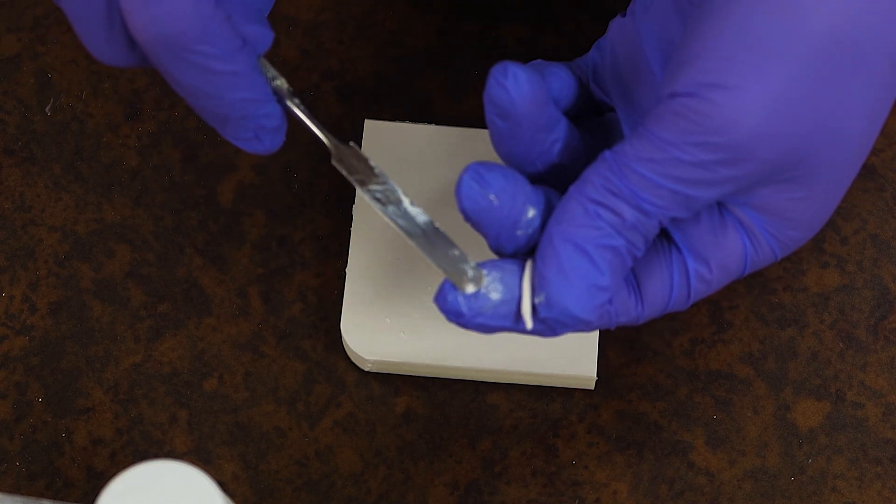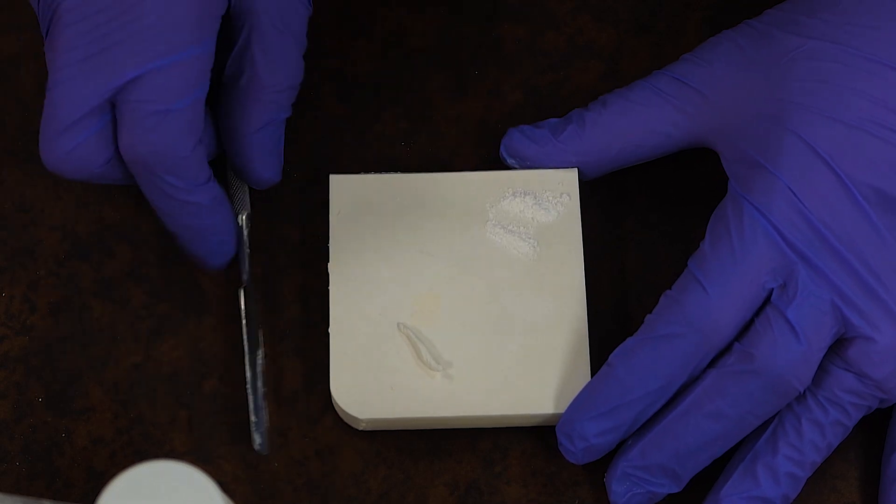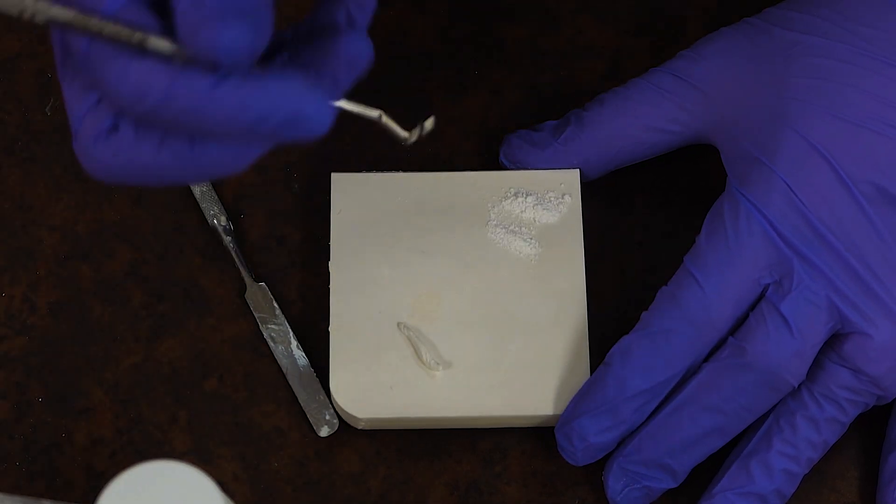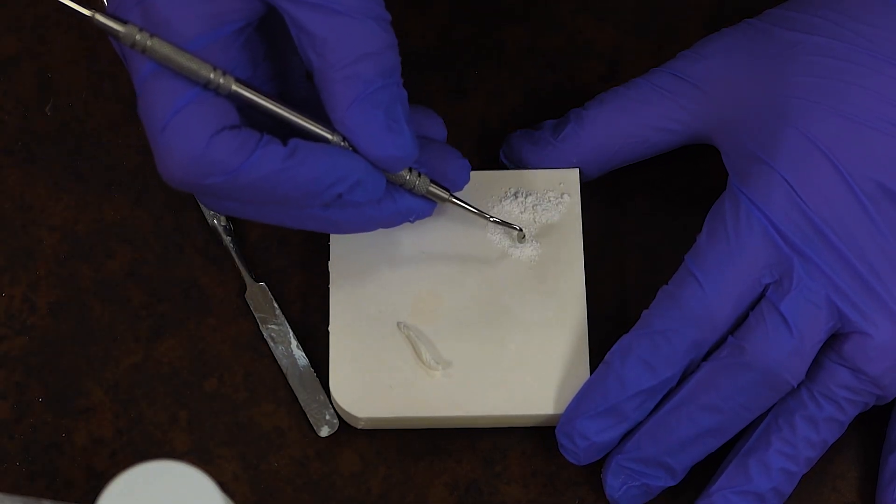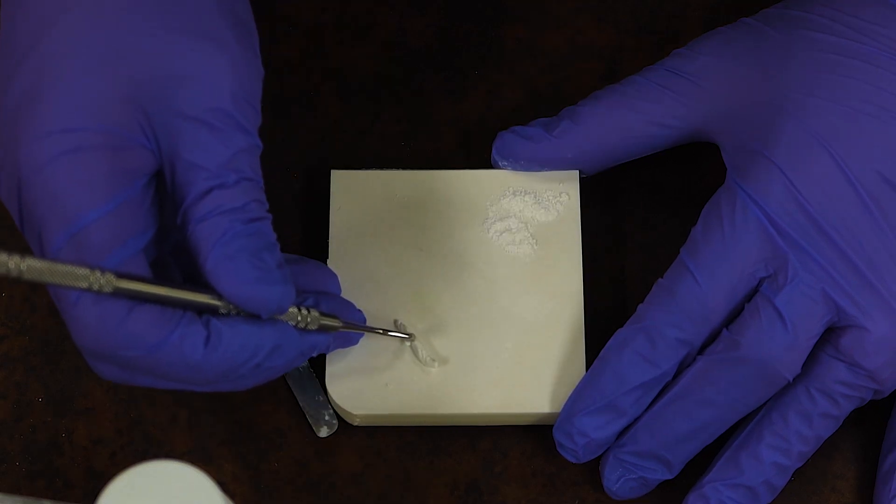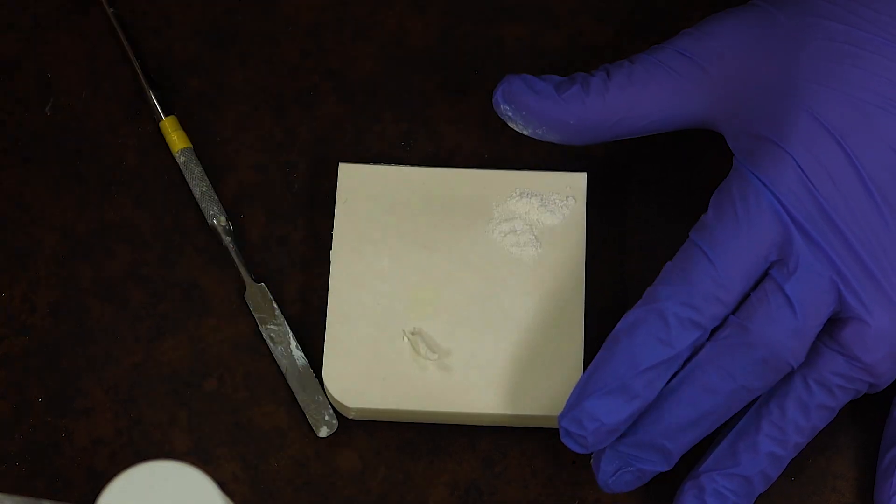The nice thing about having extra powder here is that with my instrument, my condenser, I can dip it into the powder and it's going to act as a small barrier as I pick up one of these little pieces and take it over to the mouth to be delivered.